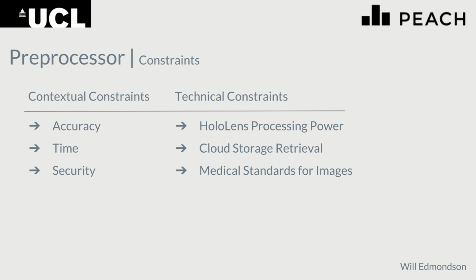by the Unity engine. A few of the contextual constraints relating to the medical setting: firstly, accuracy, secondly, time and security, and then the technical constraints: the HoloLens processing power, cloud storage retrieval, and medical standards for imaging, for example, ethics.